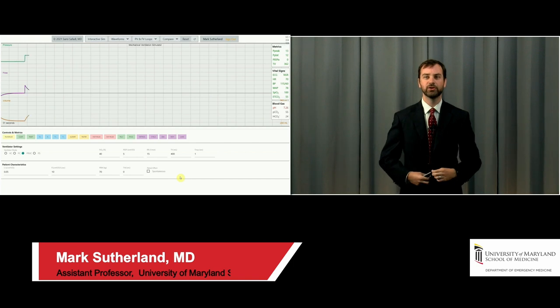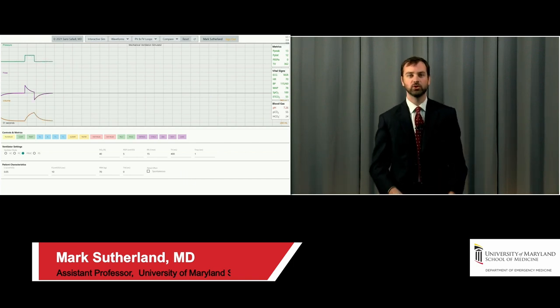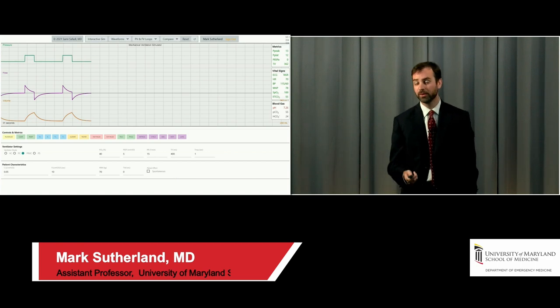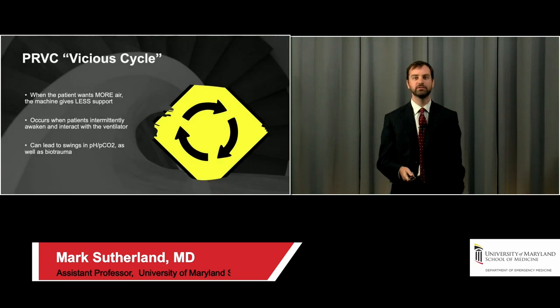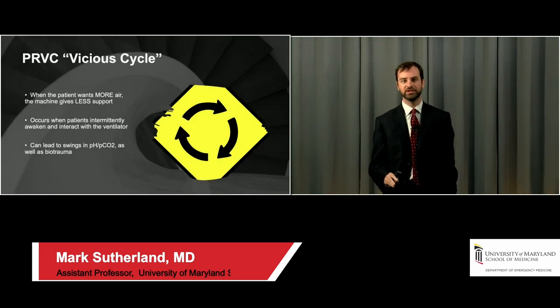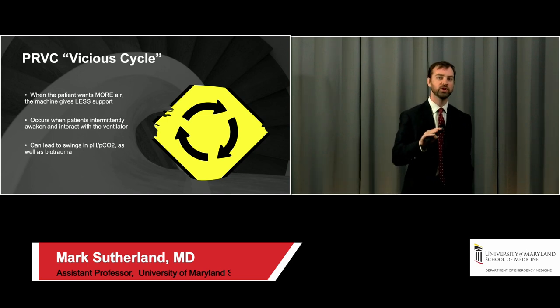So what's going to happen 30 minutes from now when that propofol we gave them or the rocuronium we gave them wears off? Well, guess what's going to happen? They're going to wake up again, and this is going to happen all over again. So that's the PRVC vicious cycle. And I do think it's a problem, like I said before, that people need to be aware of with PRVC. When the patient wants more air, the machine gives them less support.